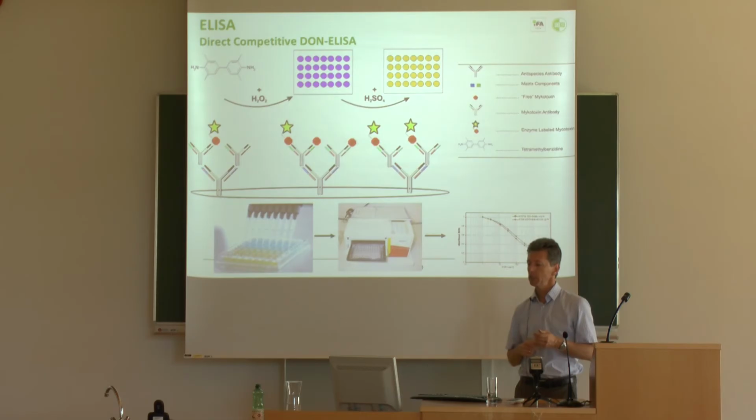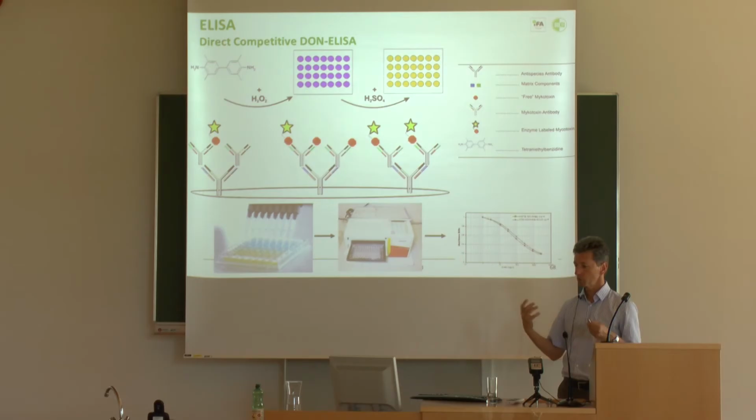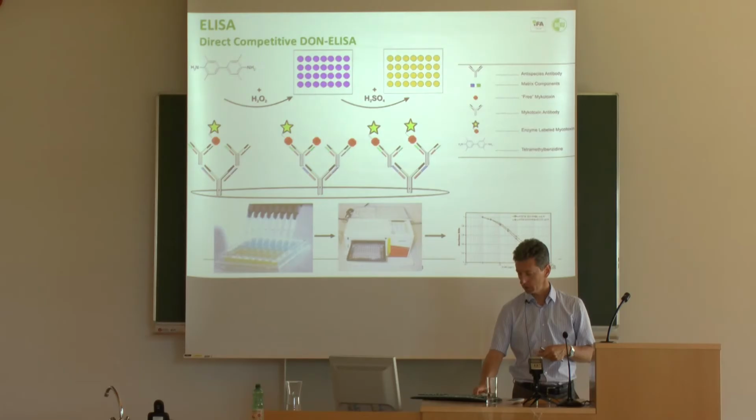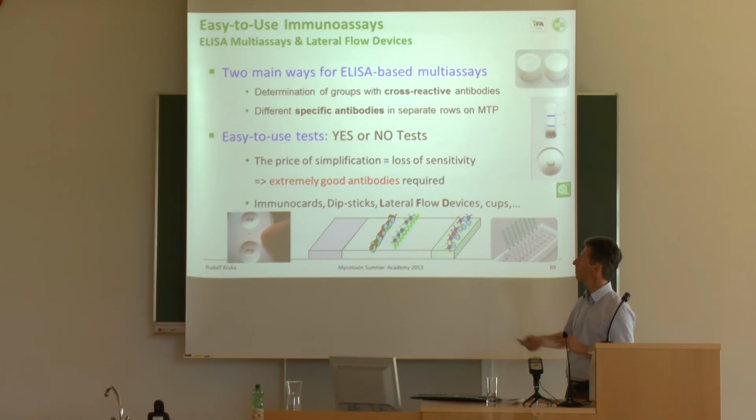ELISAs, you have got specific antibodies, so you have got a color reaction that is to be elaborated by Sabine Baumgartner. And I'm not going to go into details on that because you will have both lectures and lab training on that, but nonetheless, it's important to point it out because I'm supposed to mention all the methods which are state of the art. But let me just mention that there is a move towards easy to use immunoassays.